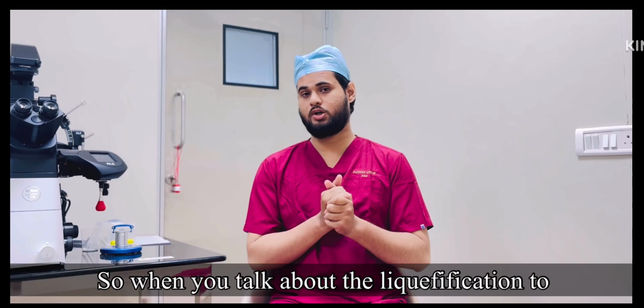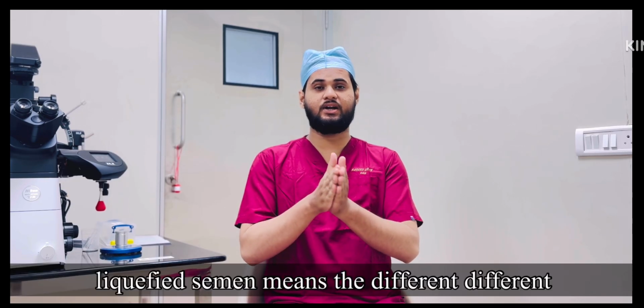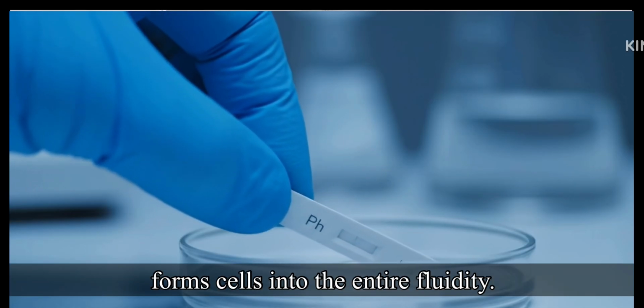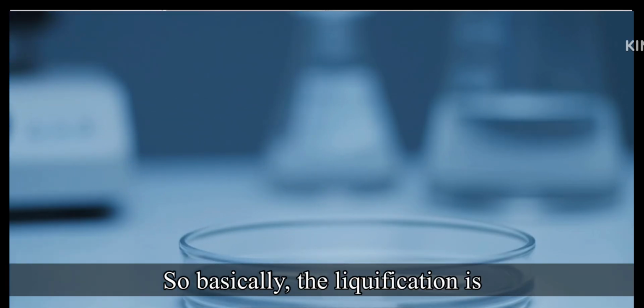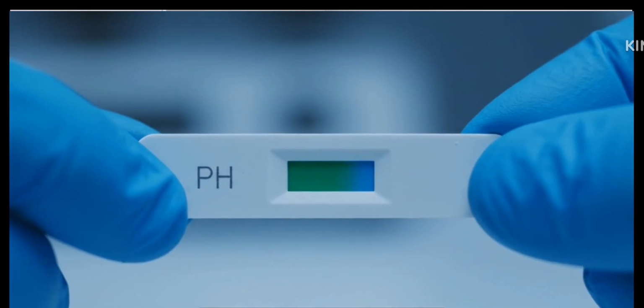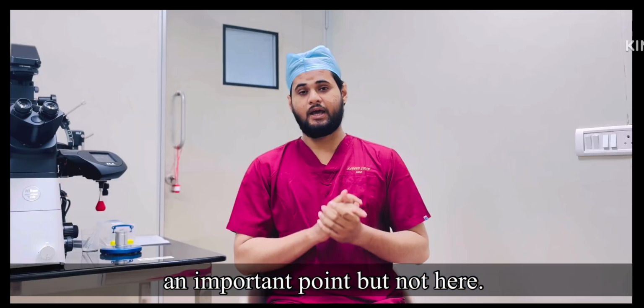Liquefied semen means a proper uniform mixture of the semen and the sperm cells in the entire fluid. Liquefaction is one of the most important parameters for recording a semen analysis report.